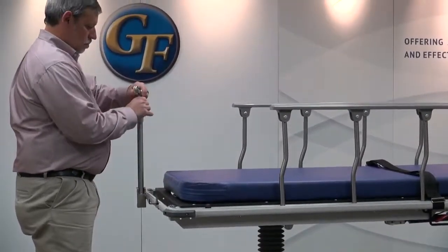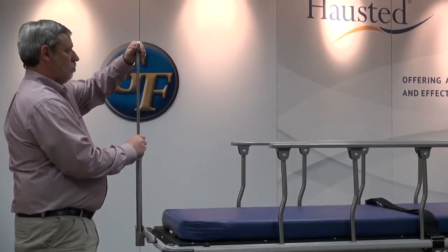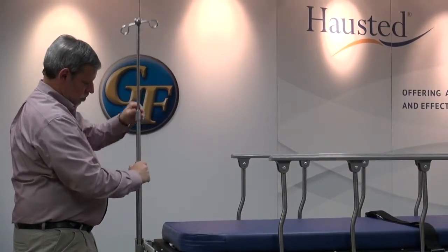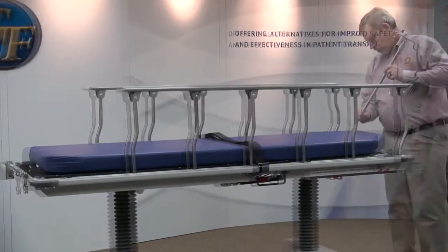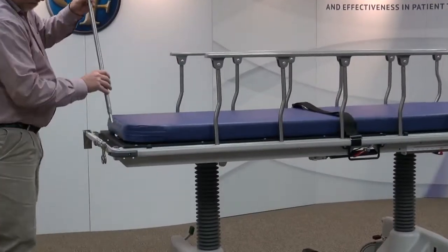A three-stage telescoping IV pole is included with every stretcher and is permanently mounted at the foot end. It can be easily adjusted between 20 to 45 inches for use and can fold to stow when not needed. There are also four built-in IV holders in the four corner positions of the stretcher for additional IV use.